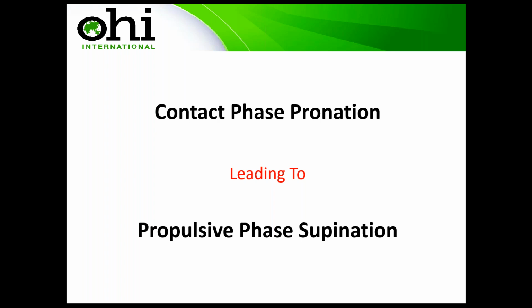When we load the forefoot early, we load the first MTP joint early, we take away the ability of it to bend. Now, sometimes it's anatomical and it can't bend physically, and I'm going to show you 2 scans which indicate that. But we don't know that from a scan. That's where we have to find out, and that's why we have to put that into the examination findings or into the notes.